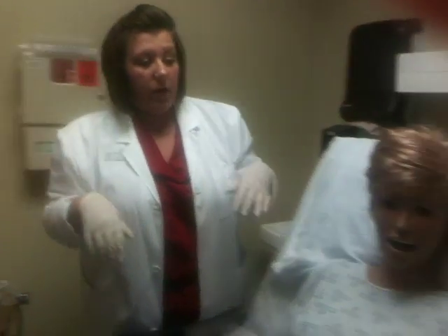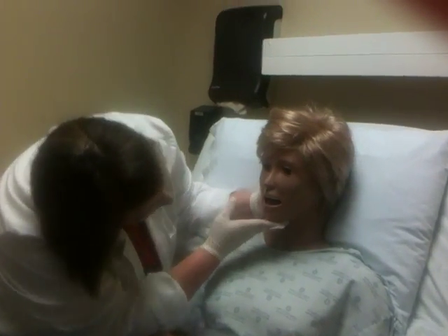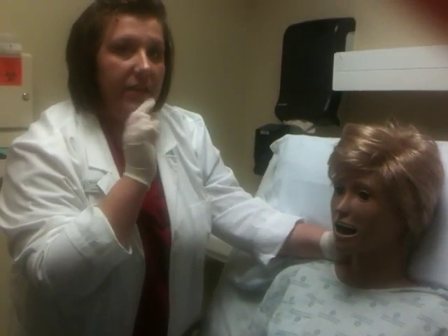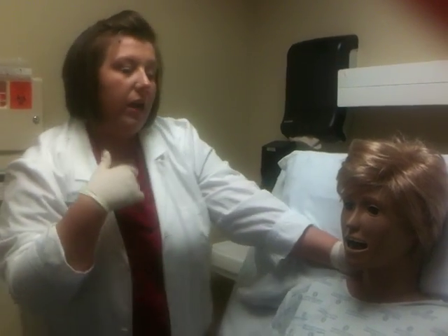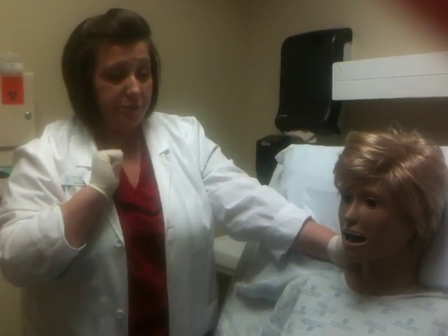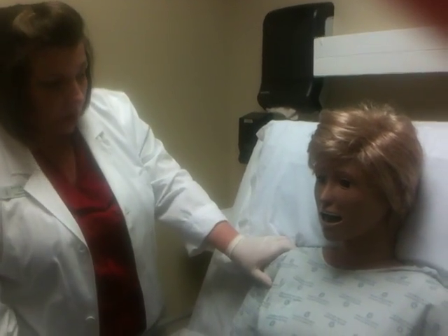All right. You could go ahead now and, all right, Miss Smith, I'm going to look at your nose. And you can look at the nose with a pen light and see if there's any septum deviation or anything that would block you from being able to use one side or the other. You could also ask her to sniff, and which side had better airflow would be the one you would want to choose. Okay? All right, Miss Smith, we're getting ready to get started, okay?